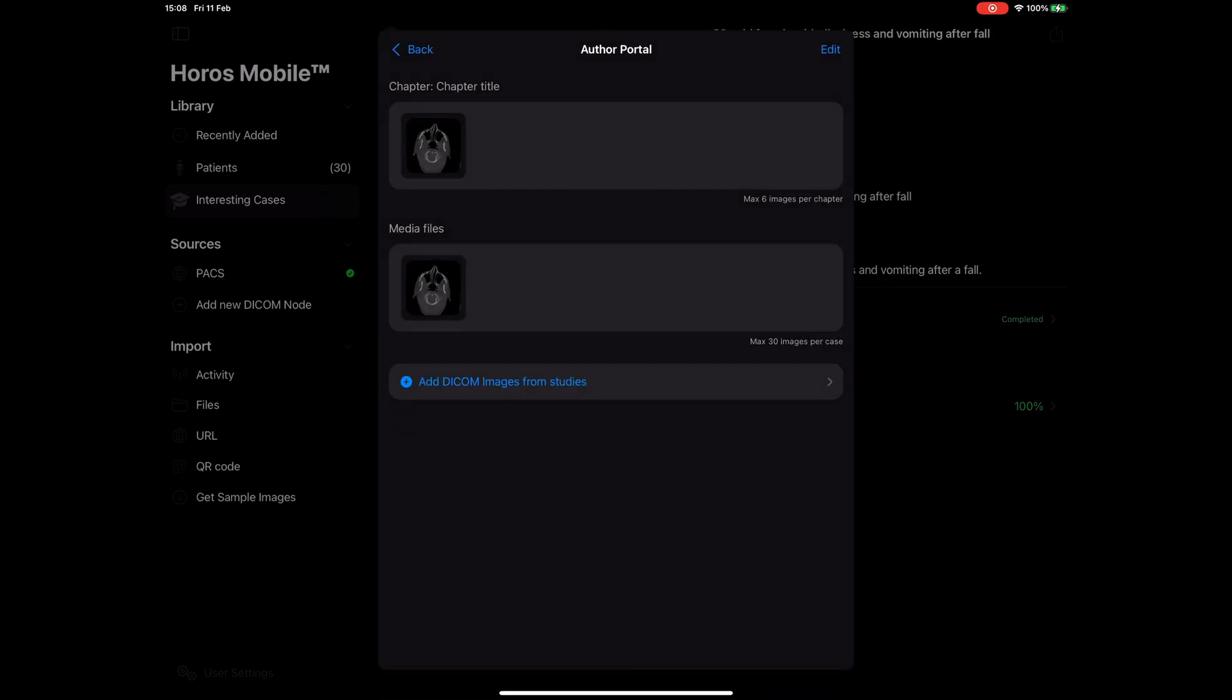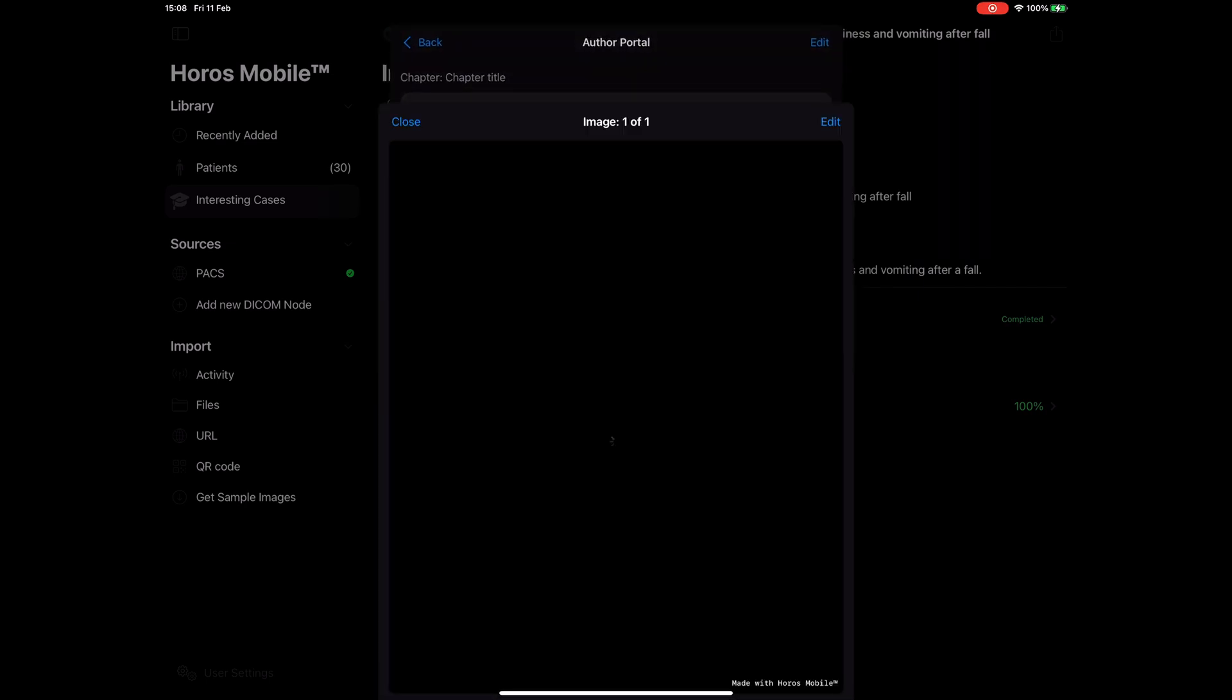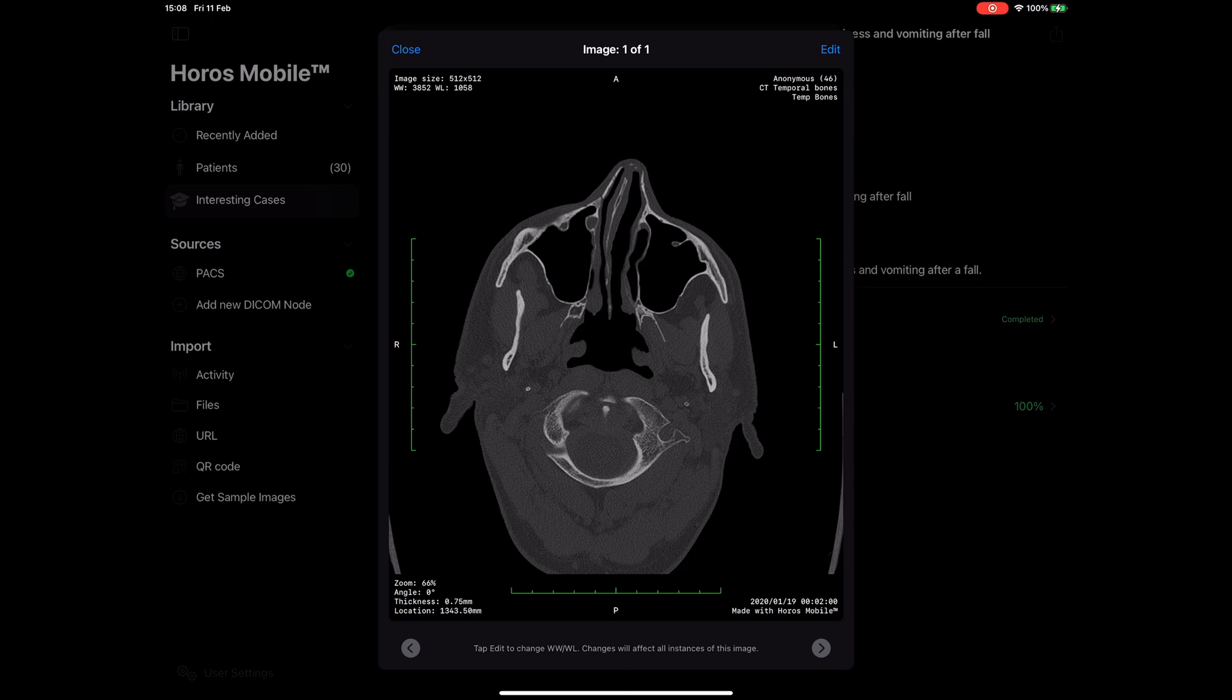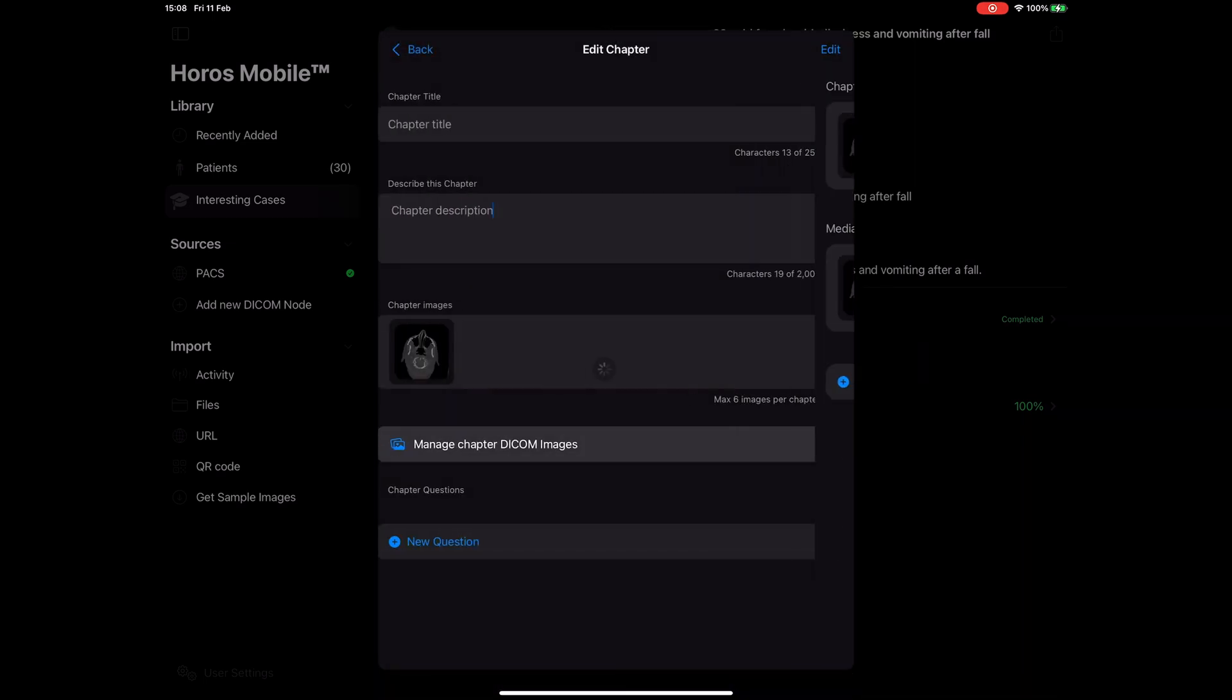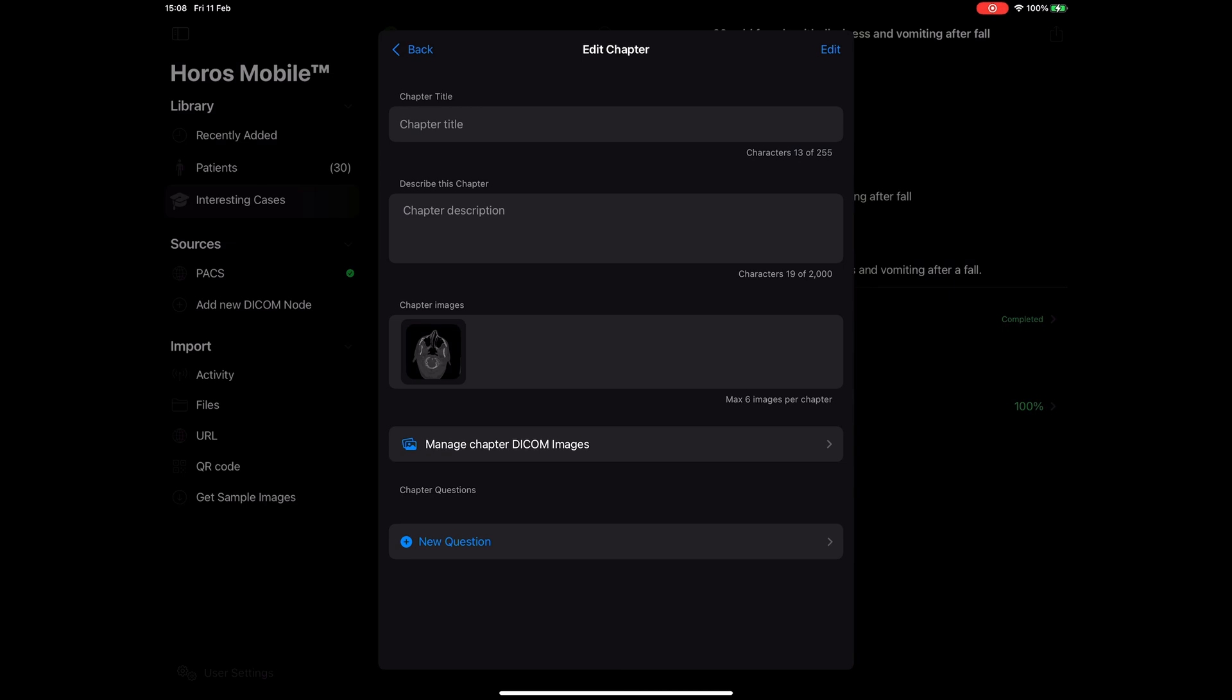This image is automatically added to the case's media pool for future use as well. When you add an image you don't have to worry about anonymizing the patient. We take care of that by automatically anonymizing your DICOM file before it is added to the case. You can add images from different modalities and from different studies. I am done adding images for this chapter.